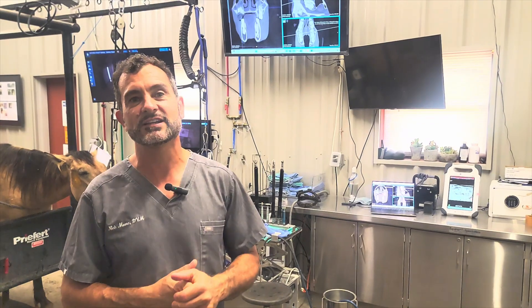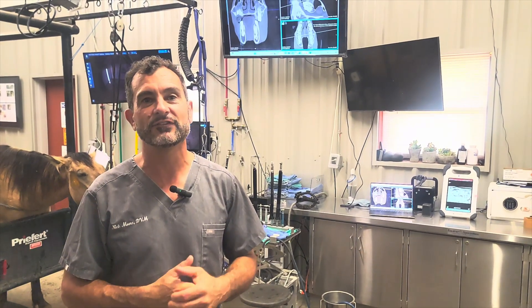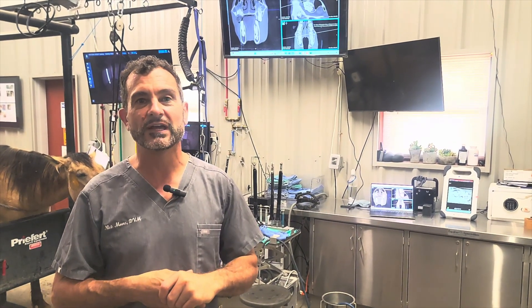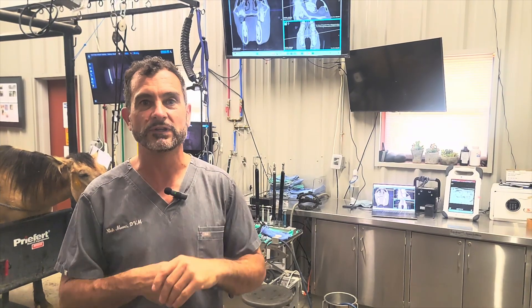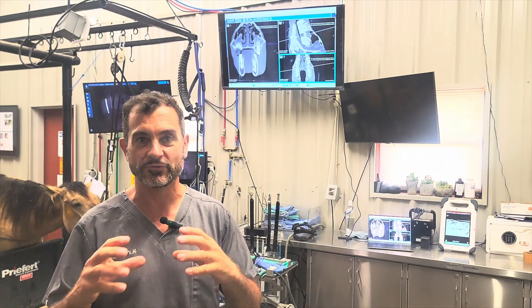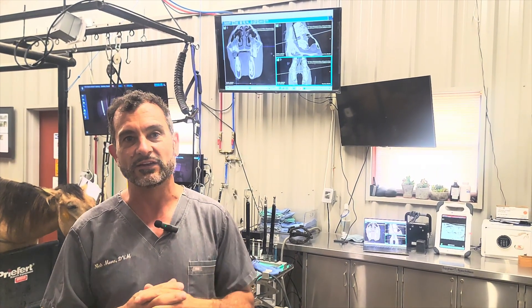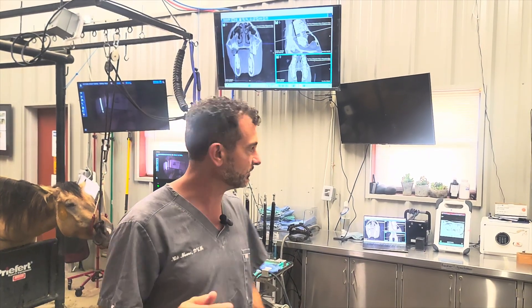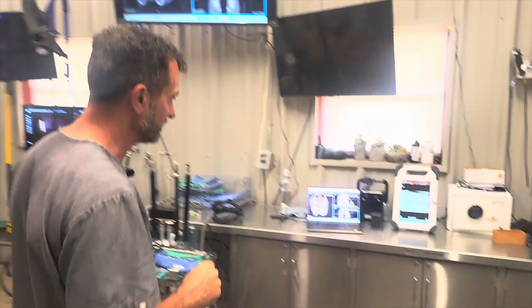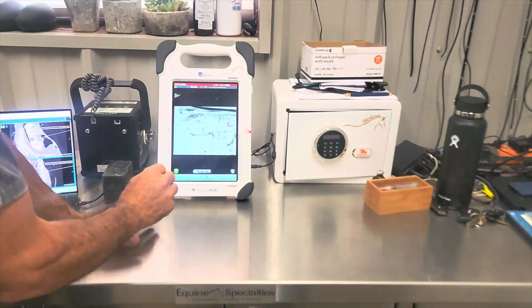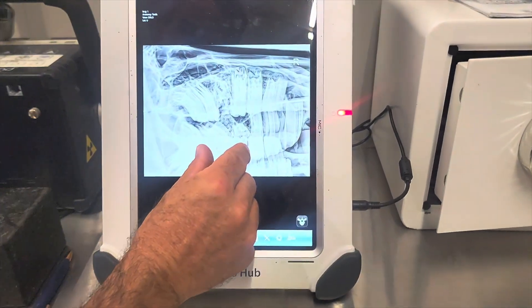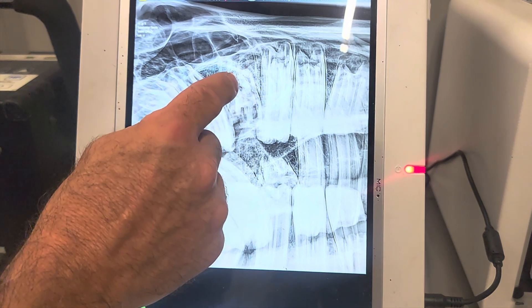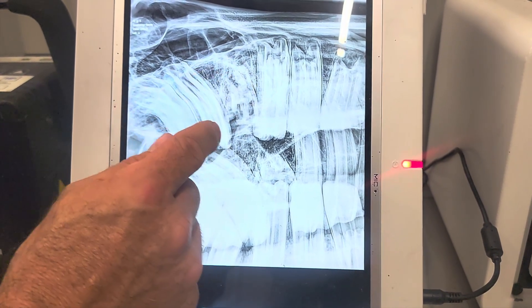Today we've got a case referred in for extraction of some fractured number nine teeth. We did a CT scan and we've got radiographs. It looks like it's going to be a challenging case, but we should be able to help this horse a lot. Let's look at the x-rays first to show what some of the challenges are. We can see that the number nine here is in bad shape — broken and infected with no clinical crown.